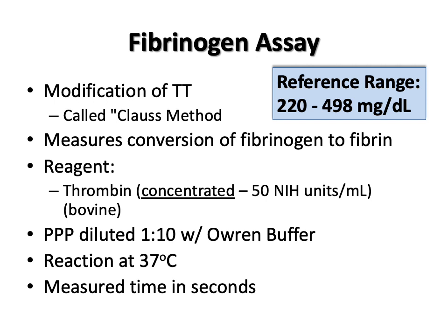Platelet-poor plasma is diluted 1 to 10 with a buffer called Owren's buffer. The purpose of the dilution is to minimize the antithrombotic effects of heparin. You can do this at up to 0.6 units per mil. It also helps to minimize the antithrombotic effects of FDPs at up to 100 micrograms per mil, and also control proteins.